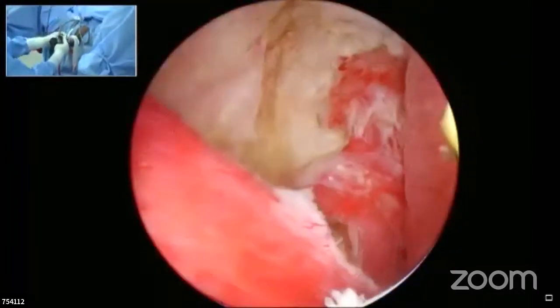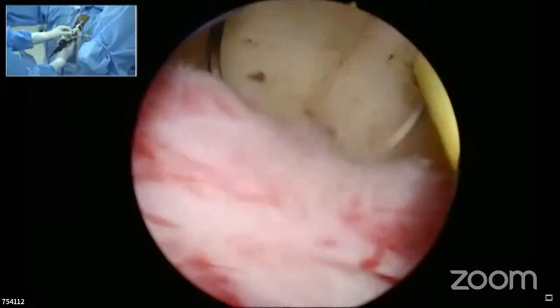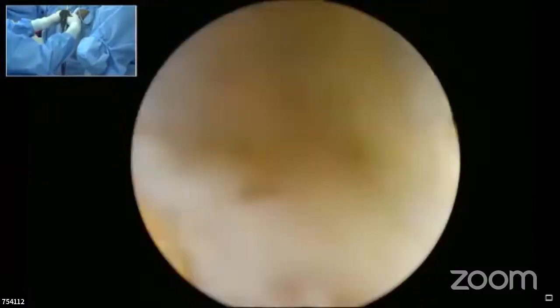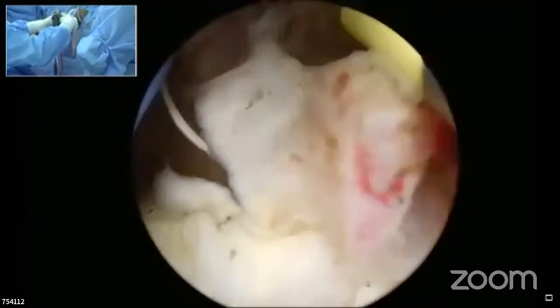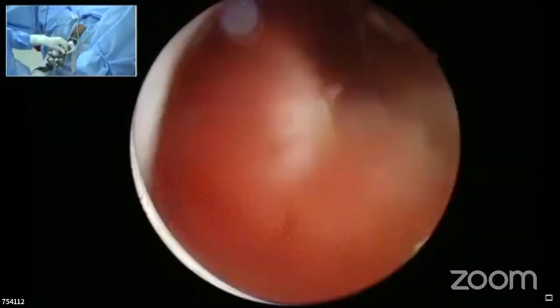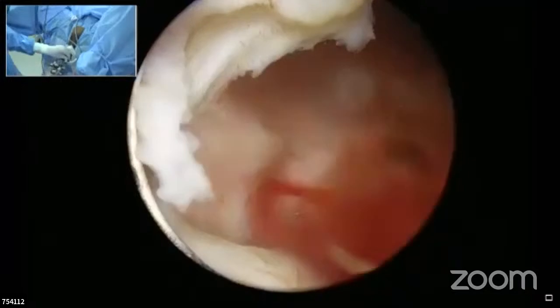I agree to that to some extent. You can do the apex later on, but as far as the lateral lobe is concerned, please complete one lateral lobe, then move on to the other lateral lobe. A lot of tissue is there on the lateral lobe actually. So go to the capsular level, so you define your plane where you have to resect. Okay, sir. You can start at 11 o'clock again, go back and start seeing from there. Gradually, yeah. Good.